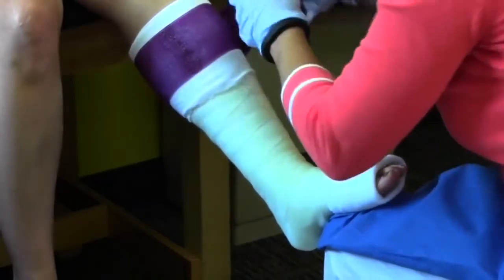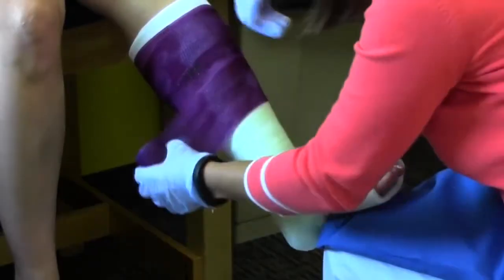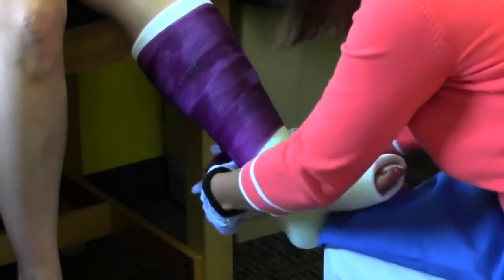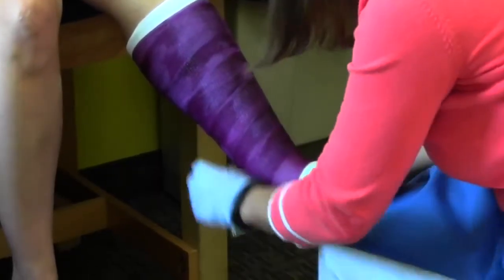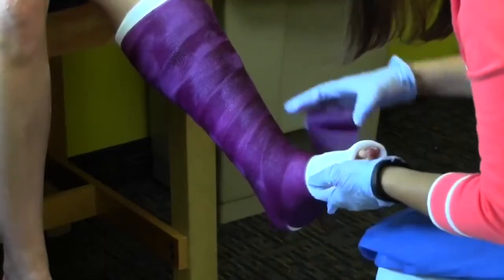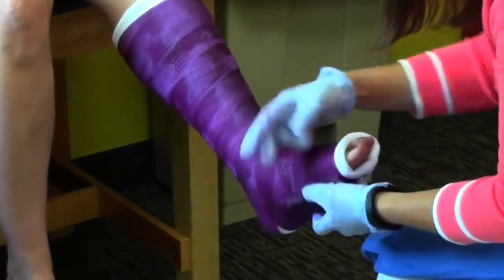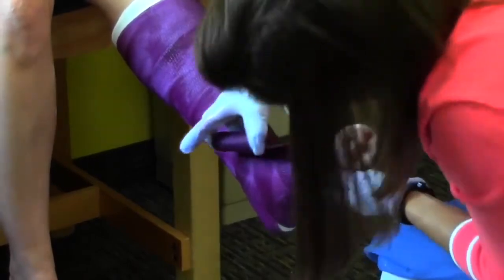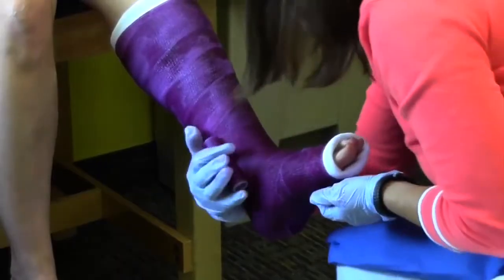If you do, then the stockinette and the padding just scooch down inside the cast, and if you look around at people walking around in casts, you'll see some of those, and it leaves just the fiberglass sticking up at the end of the cast, and it is quite painful. Imagine having sandpaper rubbing against your leg for the duration of your casting. Not very comfortable.